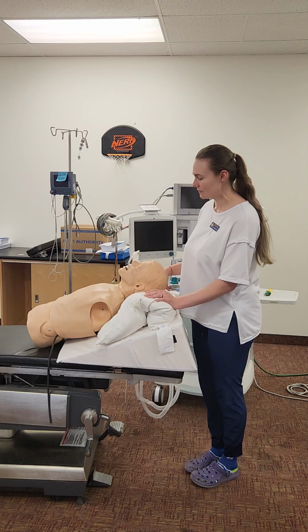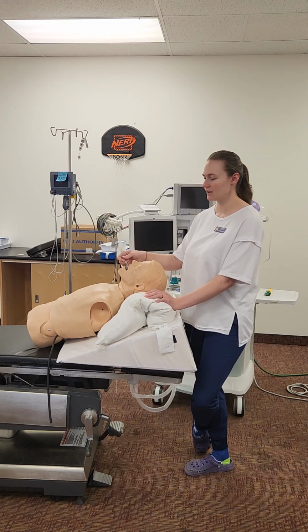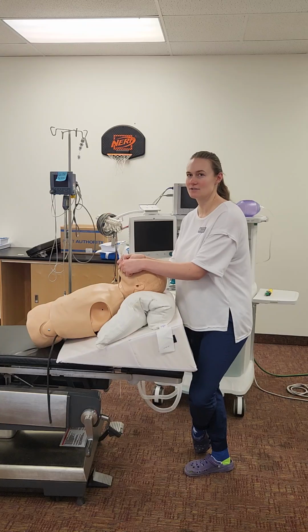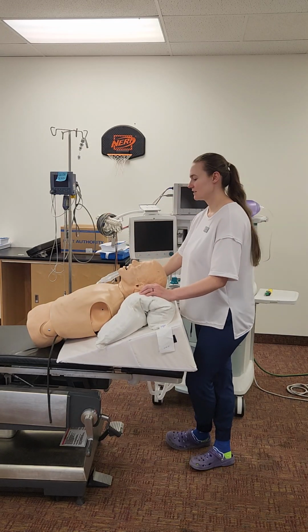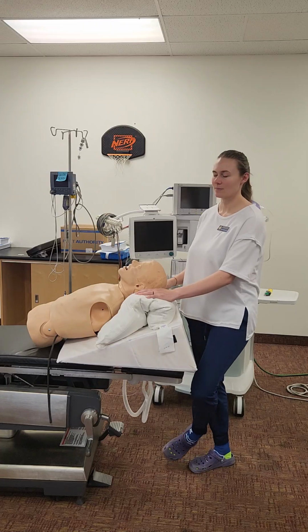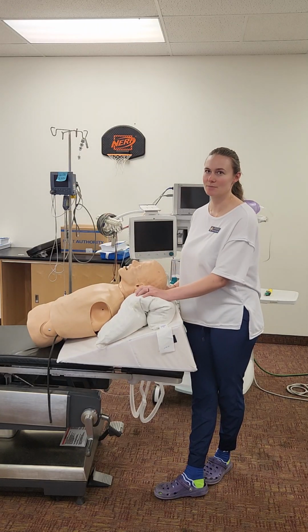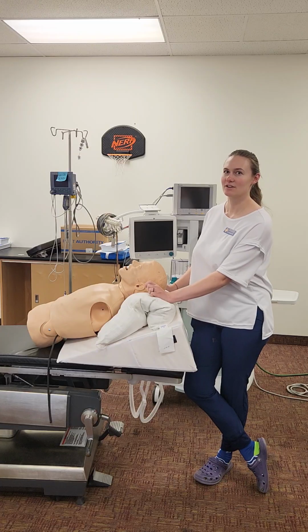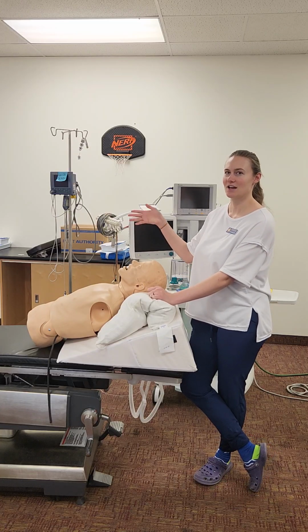So once I have all those things and I'm confident he's going to wake up awake, we can pull the tube out. So I'll deflate my cuff, pull the tube, I'll put some nasal cannula on him with 6 liters per minute going, so that he's safe and good, and I'll just transport him completely sitting up to PACU to promote adequate ventilation. And then with my PACU nurse, I'll just tell her everything that happened with the surgery.